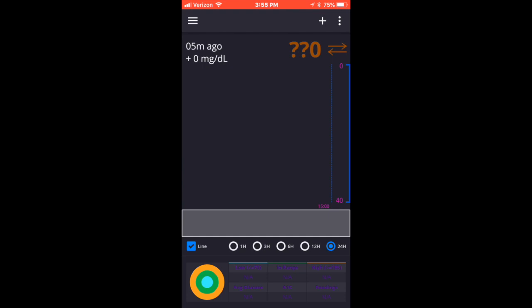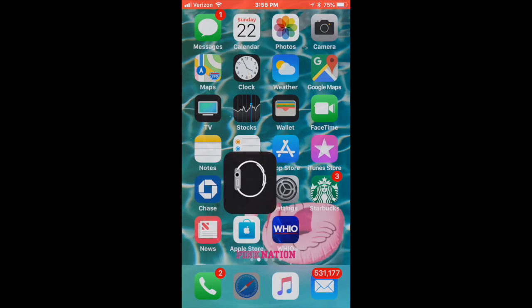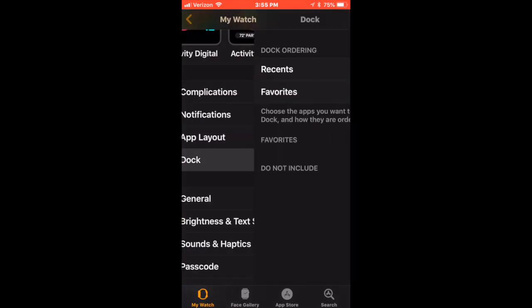Things will work out. Once you get this set up, you will start seeing all of your readings on your watch and on your phone through either NightScout or the Spike app. And right here I'm showing you the section where you can change different complications on the calendar for your watch.